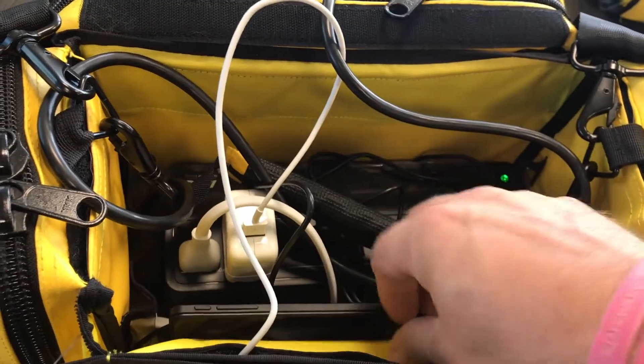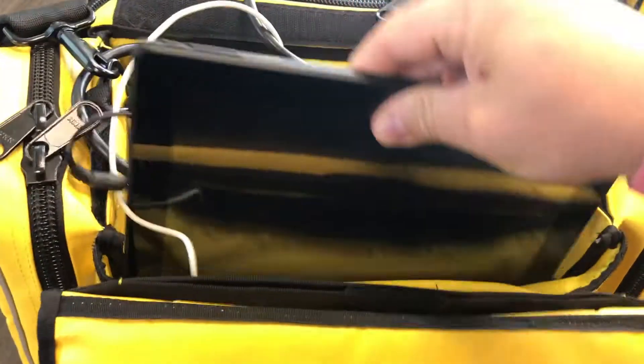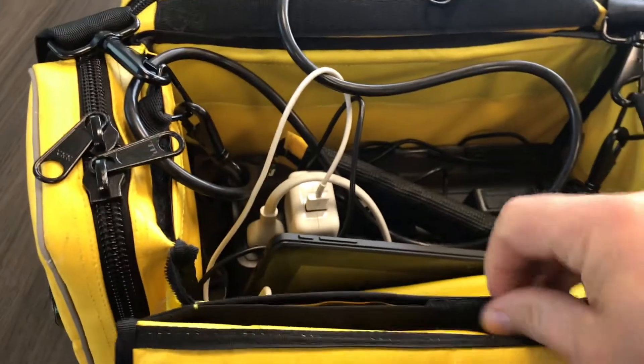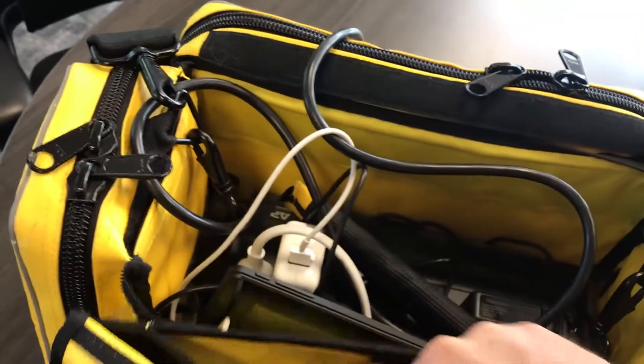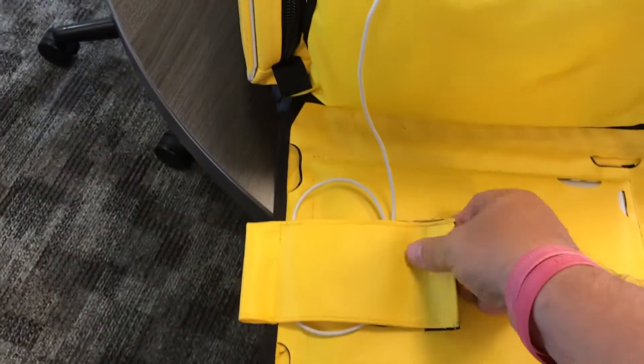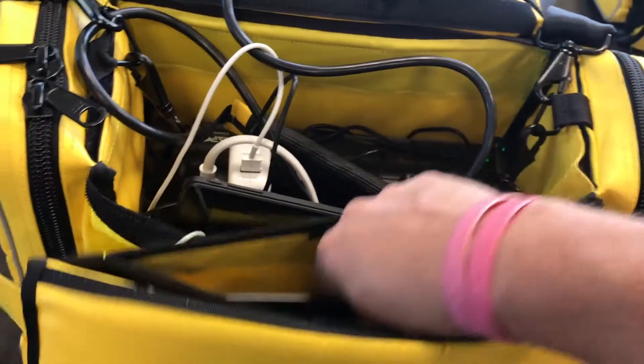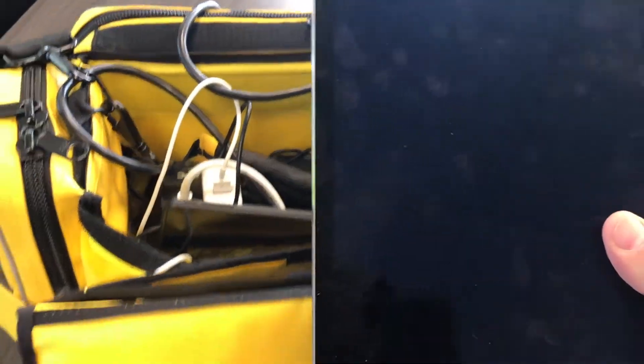We have some iPad charging cords here and we have two iPads in here. This one is the instructor pad, and then on the front here — if I can open this up — you have the iPad that would be the monitor. You can see it's plugged in here. To get it out, you just unplug it, go in here, open it up, and get the iPad out.